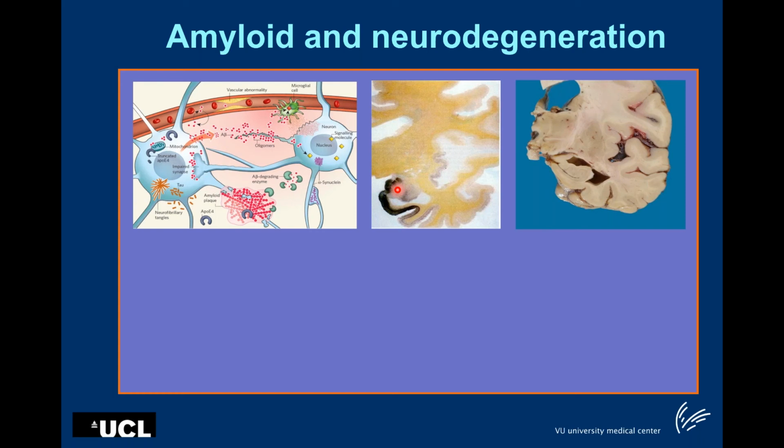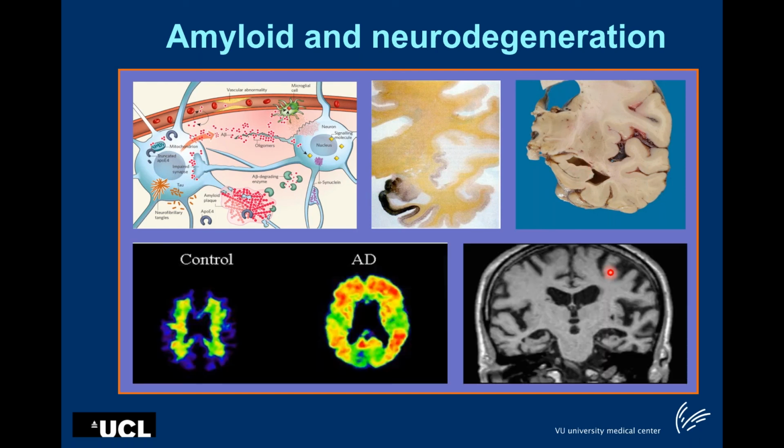And then, because of the tau pathology, there's dying of neurons with subsequent neuronal loss and atrophy of the tissue, with subsequent widening of the surrounding CSF spaces. On imaging, we can see these two ends of the spectrum. On the one hand, the volume loss that we can see on MR, but obviously this is a relatively late phenomenon, by which time you've lost a lot of neurons already in brain tissue. Whereas the early biochemical pathology we can see with amyloid PET, which is a very early phenomenon, and we'll discuss in a bit how early and how useful that can be.